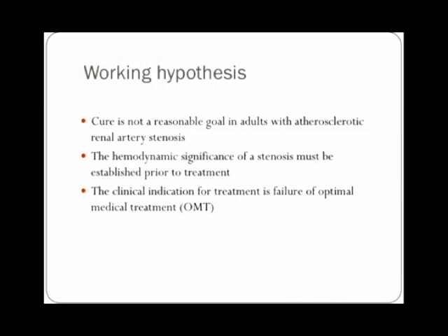So you really should try to, I think, strive to measure the pressures concurrently so that the pressures are synchronized between the intrarenal pressure and the pressure in the aorta, and figure out how you can do it and what you're happy with. And as I said, you don't really have to do it on everybody. You just have to do it on those patients that you know are in question.